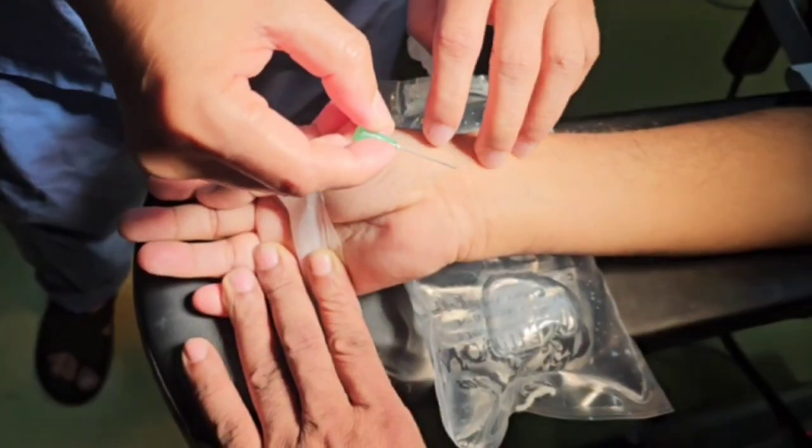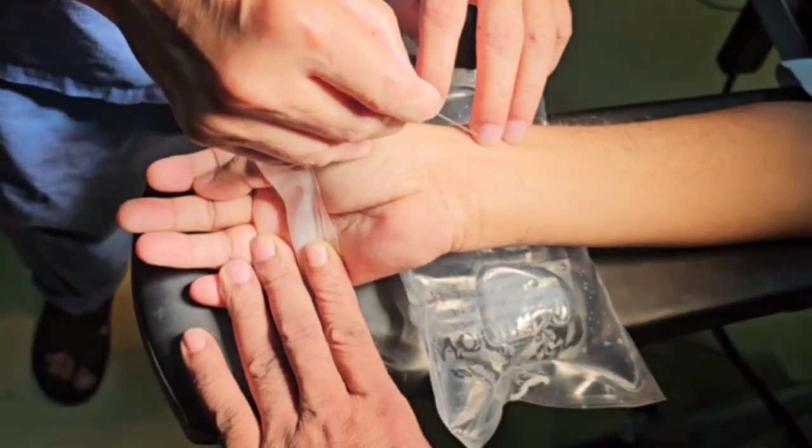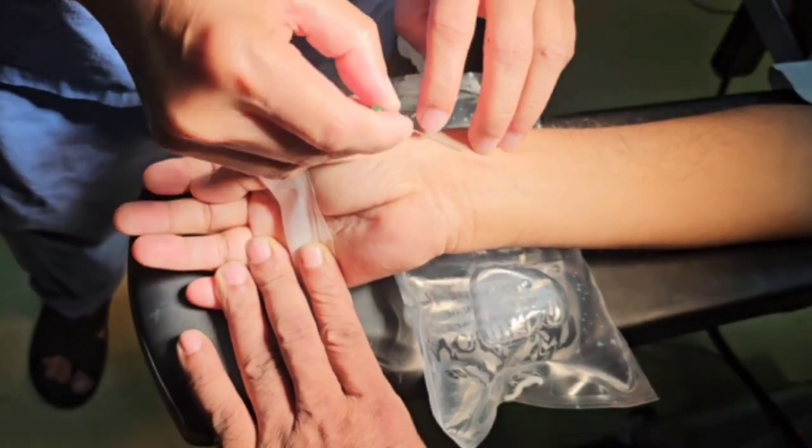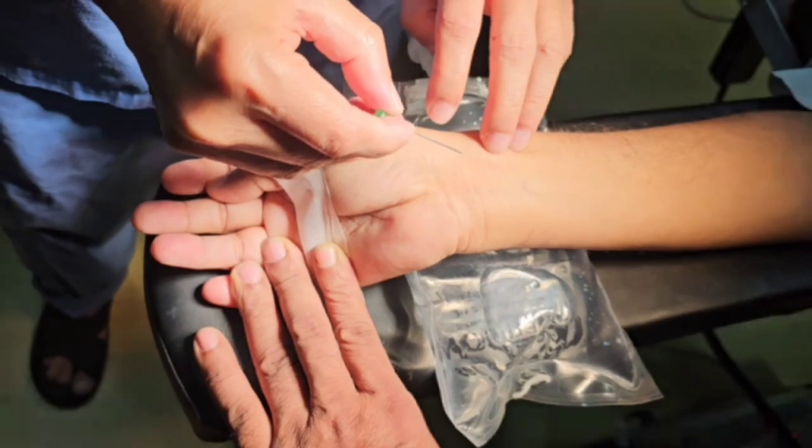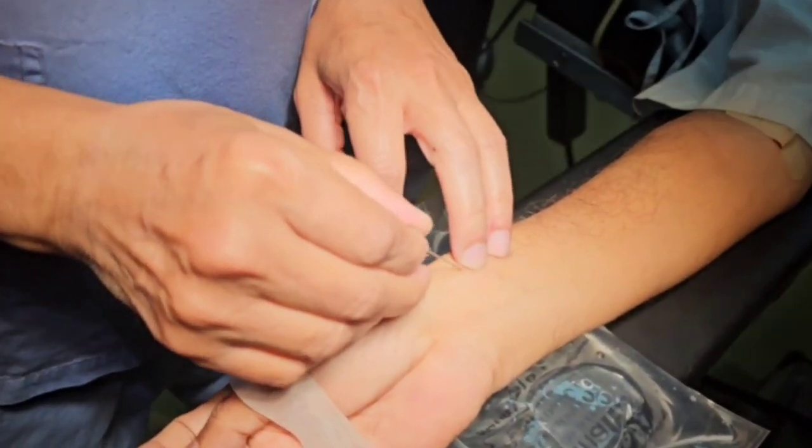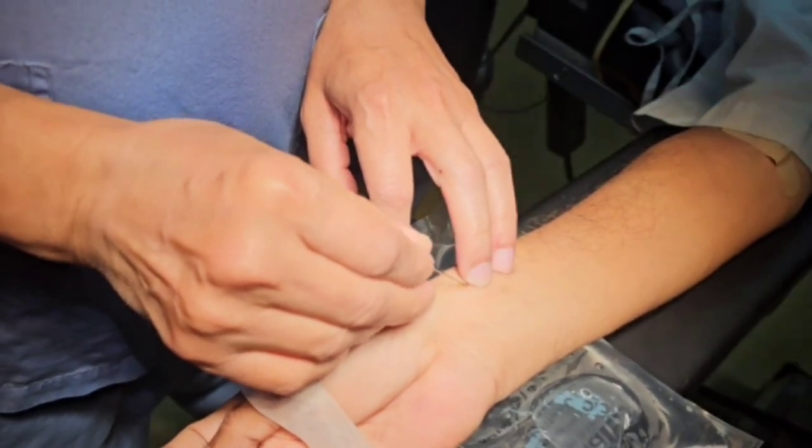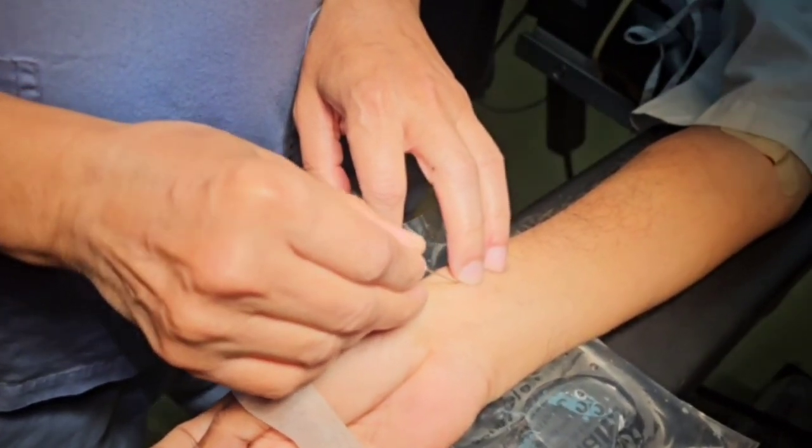There are usually two techniques for arterial line placement such as over the needle technique and over the wire technique. In this video we will approach with over the needle technique. For this approach we will insert the arterial catheter with needle.